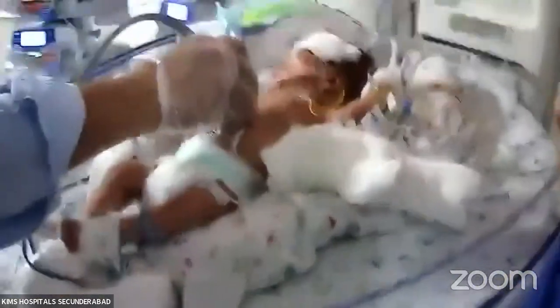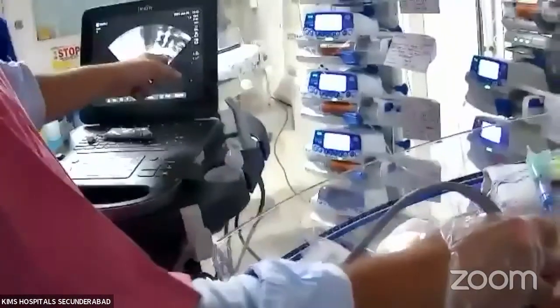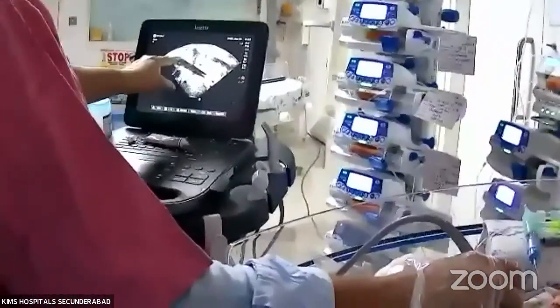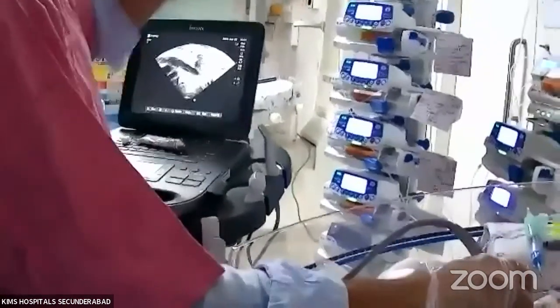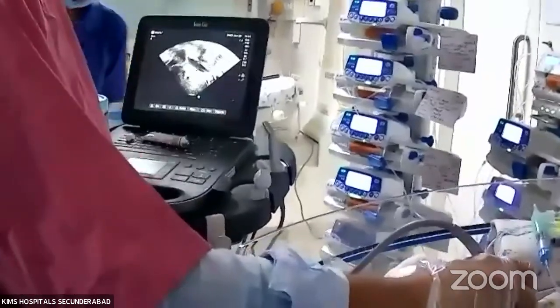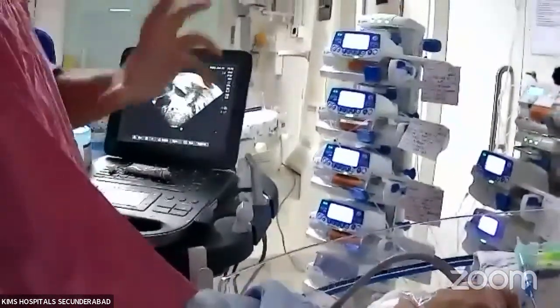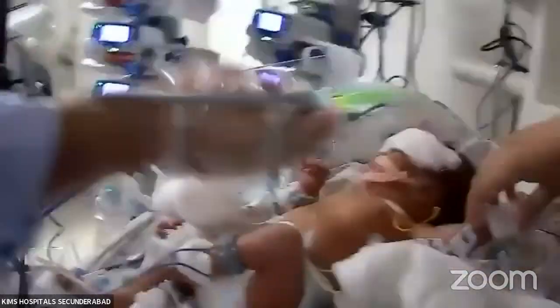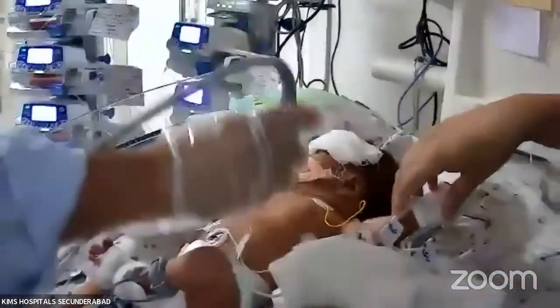which is seen in the TAPVC. Okay. Now you see there is some catheter, and we know there is an umbilical artery catheter there. You can see the catheter in that. Okay, so this is at the higher position. Above the diaphragm is the level of the UAC at the higher position. So with that, you can know the UAC is at the high level position. There are two levels, low and high. In between, we are not putting. It's a high level, that is the correct position above the diaphragm. That's the first thing. Now, second thing, I'll go with the subcostal.